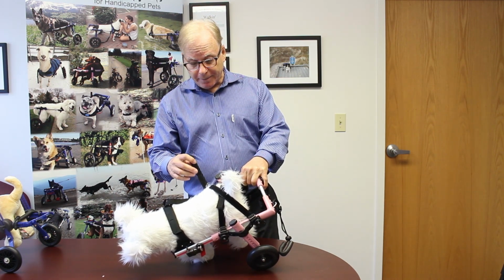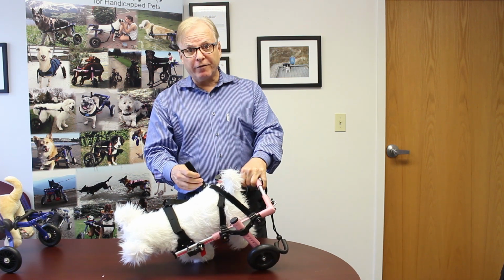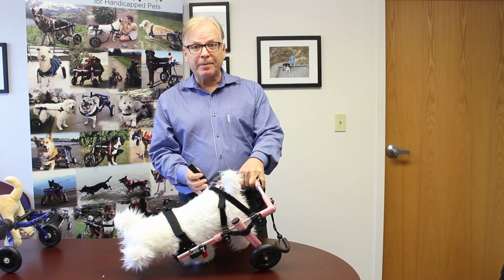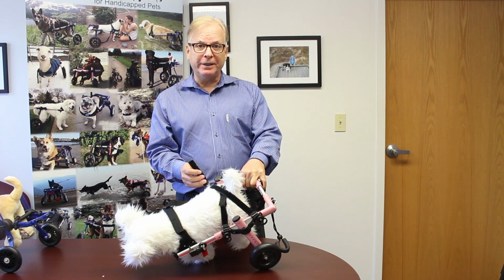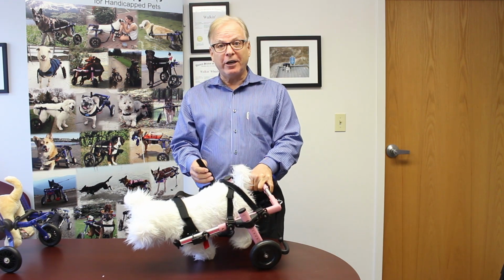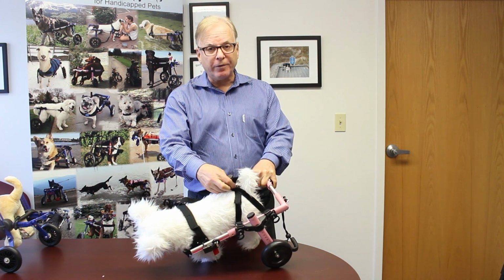One of the items you mentioned was these straps that attach on the back. And you mentioned that you felt that they were excessive. The reasons we put them there, for one, are to give the leg rings adjustability. We need to be able to order this wheelchair with one simple measurement of height. This makes it easy to get a wheelchair to somebody quickly and effectively. So to do that, we had to make it very versatile.